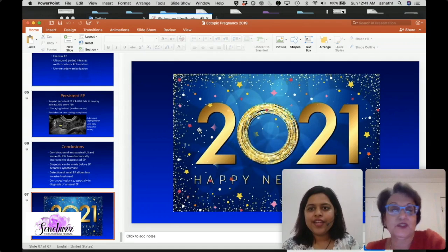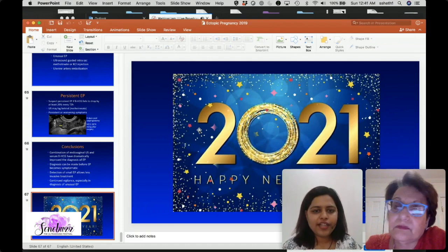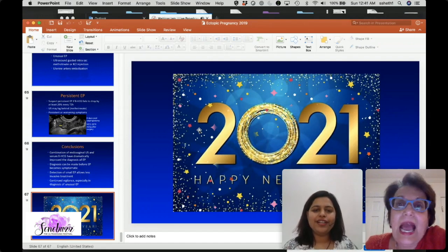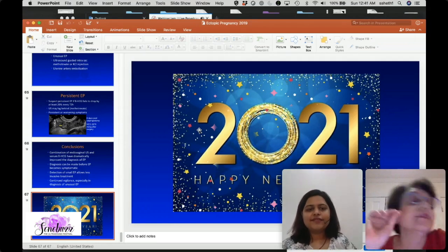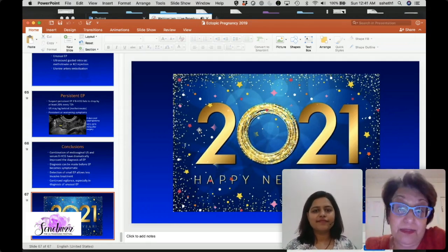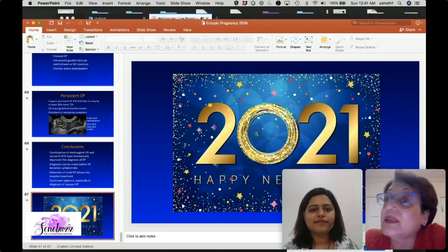Sure. One question is about tips to diagnose ovarian ectopics. You have already discussed that it's difficult. Honestly, I have seen only one case of ovarian ectopic pregnancy, and in this case we were lucky because there was a yolk sac.